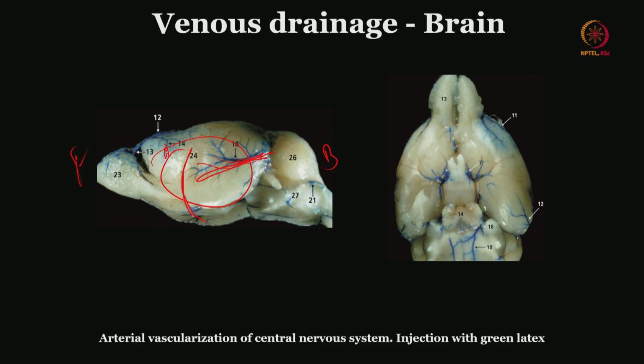This is the artery there, and that is the vein. Very important that you target only that part of the artery which is going to cause ischemia or destroy the blood supply of that particular area of the brain. Alright. If by chance you are going to injure this vein, then this entire brain is going to get infarcted, and the rodent usually succumbs, and you lose the animal that you are dealing with.